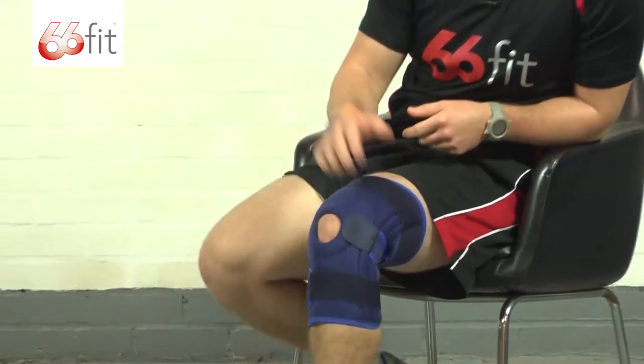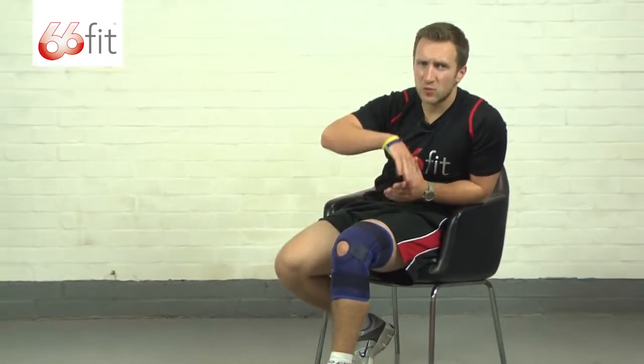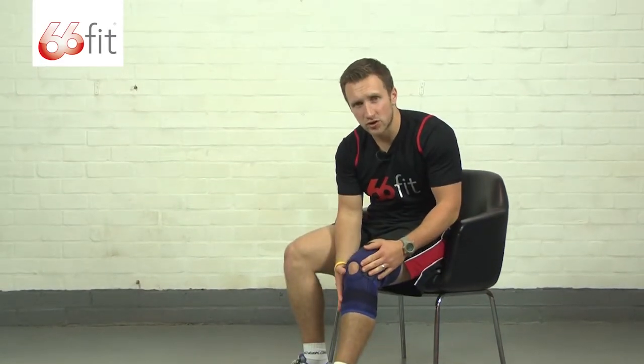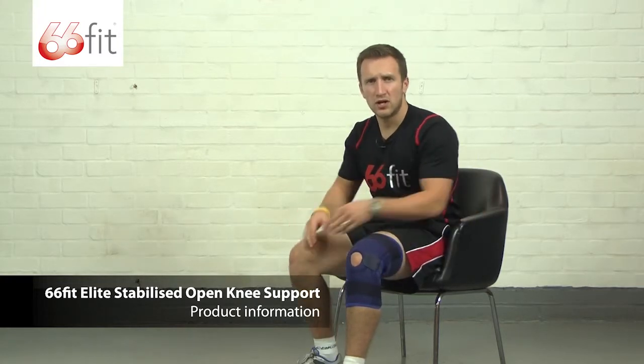It's a one-size-fits-all product so it covers a wide range of sizes, and you've got plenty of adjustment with the three different straps. It's also a unisex product, suitable for both men and women. Finally, it can be used on both legs, so you don't need to worry about buying a specific one for the left or the right — you just buy one and you can use it on either leg. Thank you very much.